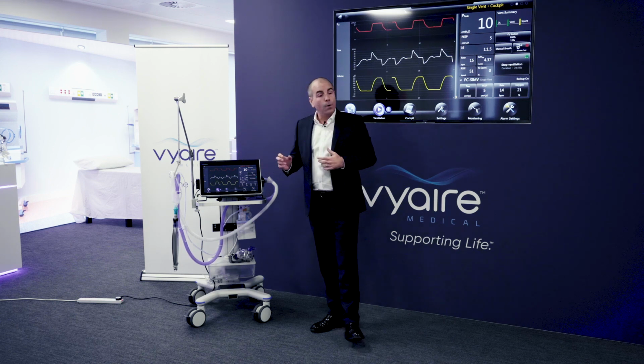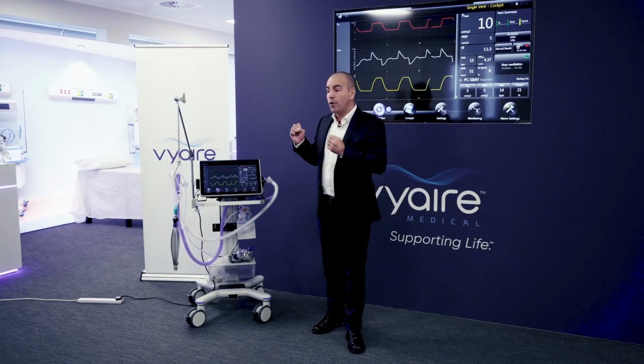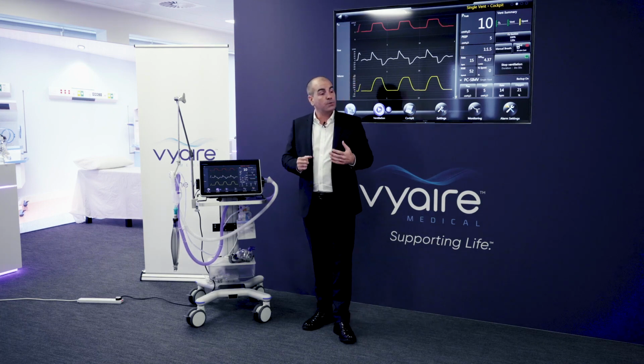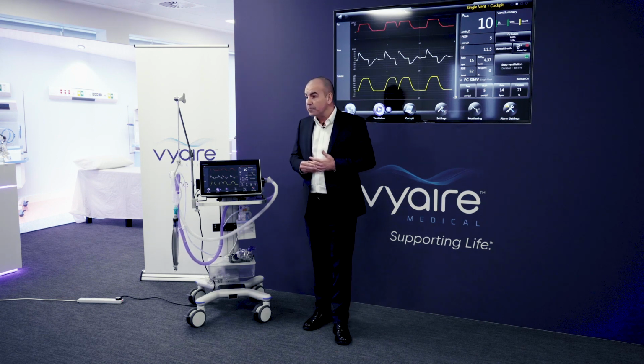So essentially what we've done with the bellavista platform, we've taken all the best bits from conventional ventilators and all the best bits from non-invasive ventilators and put them into one box so that we can go at least toe-to-toe or exceed in the marketplace, which is getting increasingly congested and competitive.